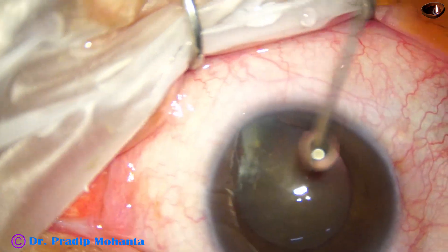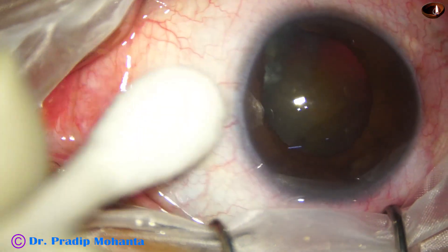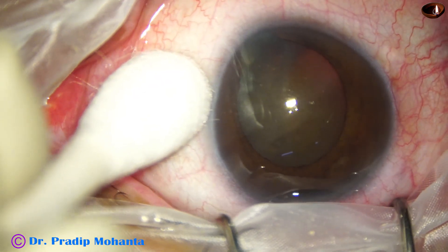The ocular surface has been thoroughly irrigated with betadine, applying few drops of povidone iodine. And now we are going to start the surgery.